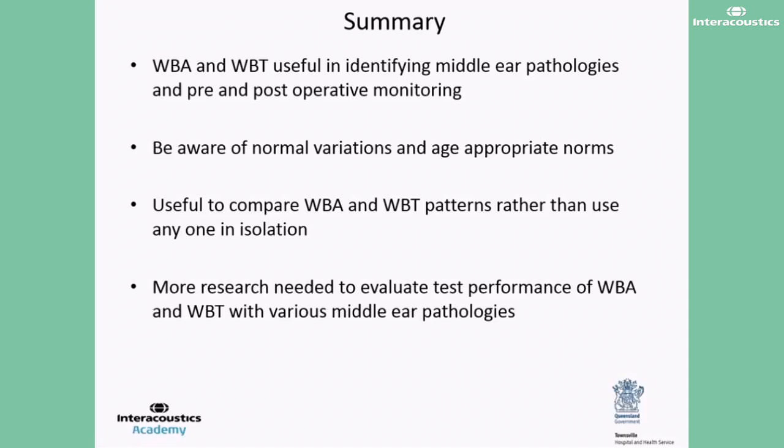We do find that we work quite closely with the ENT clinic, and then we see that if the grommets or the PE tubes are patent, we do get the normal absorbance in the mid to high frequencies with a slight increase in the low frequencies. However, if the grommets are blocked, and if the effusion is building up, then we see reduced absorbance across a region. And then they do show quite a clear difference.